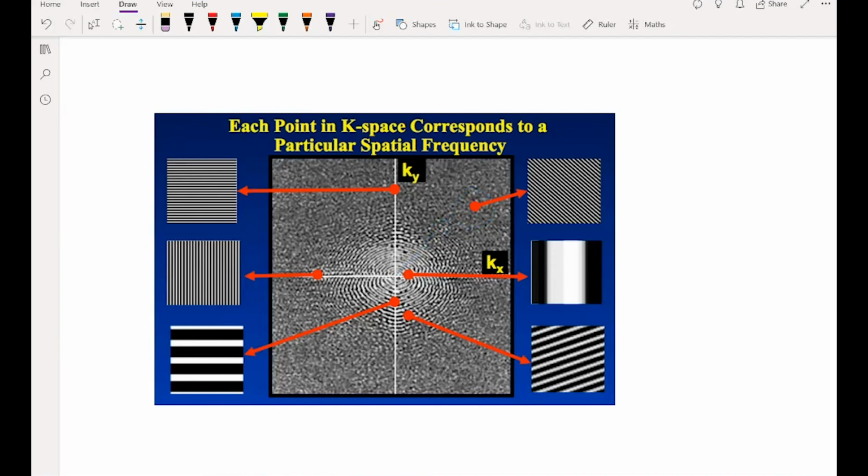You can see that there are many, many points collected in K-space, so we have a lot of information to work with and a lot of nuance, and that can give us a really detailed look inside the body. That's basically why the password to these sessions is MRI magic, because once you get to this level, the things that we're doing to look inside the body are kind of insane. We have all these magnetic fields going on, and then this really fancy math and this strangely abstract K-space, and then all of a sudden there's a picture of the brain. It's kind of insane.